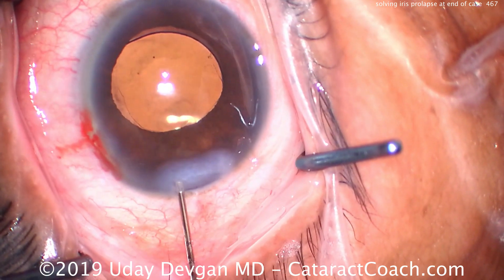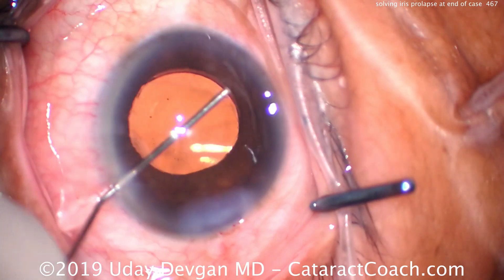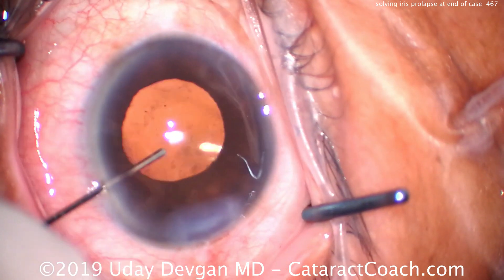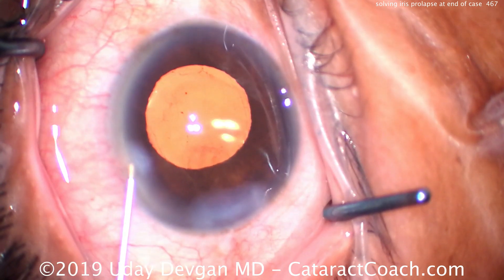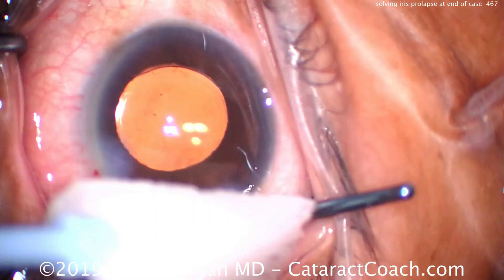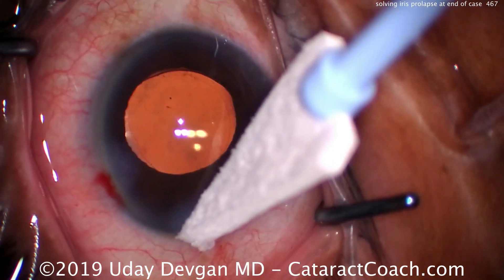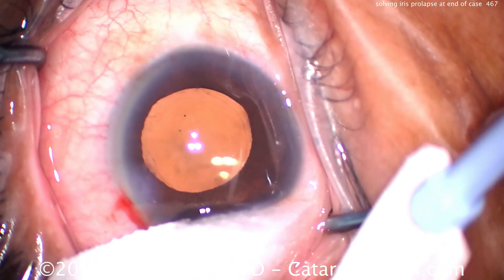Seal up and hydrate the main phaco incision — back and forth — keeping the AC relatively shallow. Now once we've sealed that up, go through the paracentesis to deepen the anterior chamber further and make absolutely certain there's no iris in the incision. You don't want any iris stuck in the incision — it will cause a big leak, be a nidus of infection, and be bad news. If you have any doubts, go ahead and put a stitch in. In this case, I'm sure it's going to be okay. We'll check the incision — it'll be perfectly dry, and the iris is now flat and away from the corneal incision.